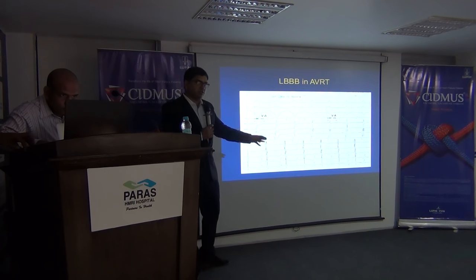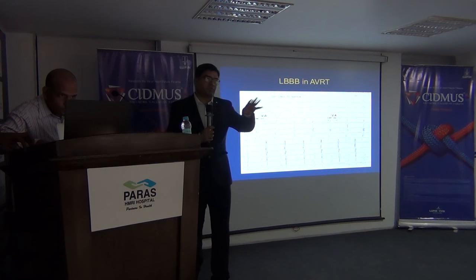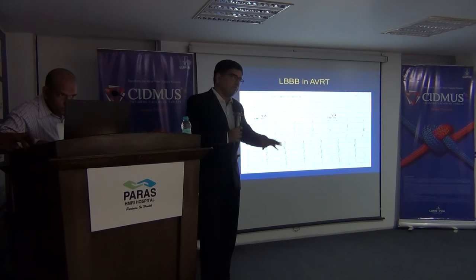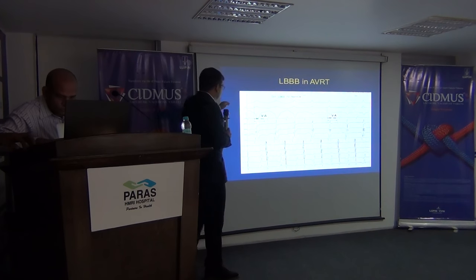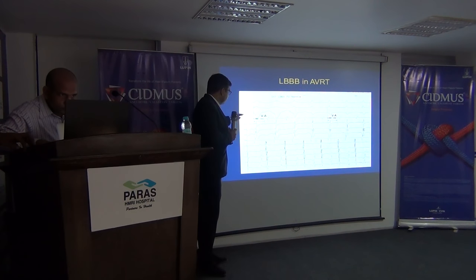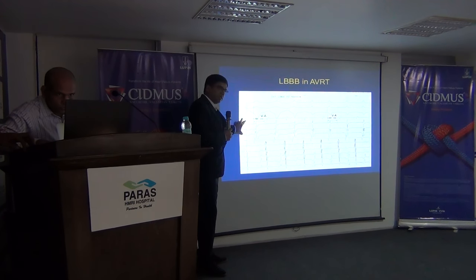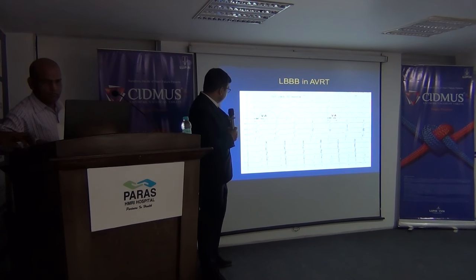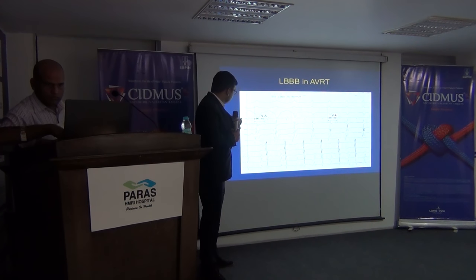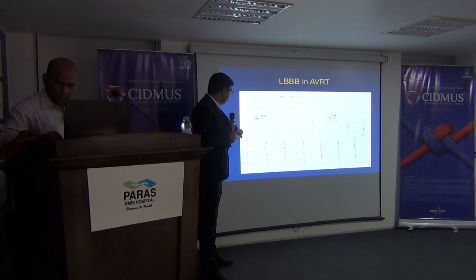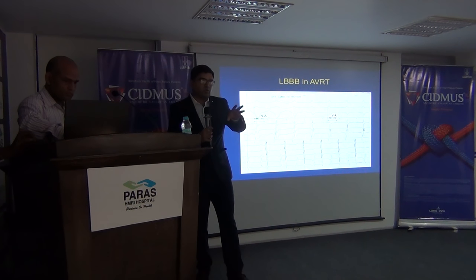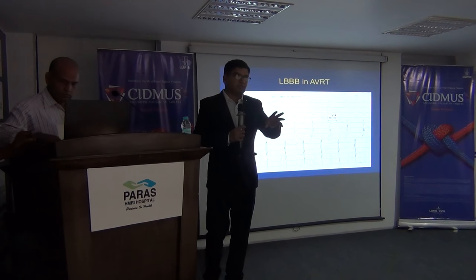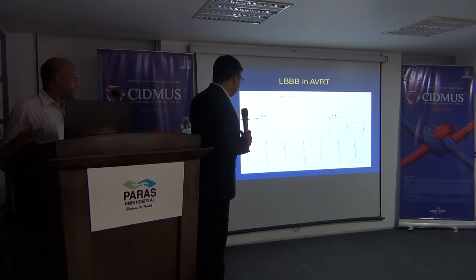So this is the tracing which everyone has to face in the EP lab. What do we see? Not only the surface ECGs, but also the intracardiac ECGs as well. These letters stand for HIS-bundle ECG recordings. These are from a quadripolar catheter which has been kept in the HIS-bundle region.